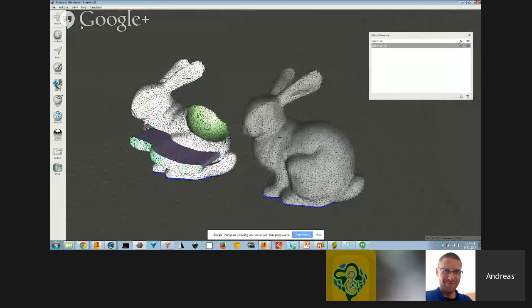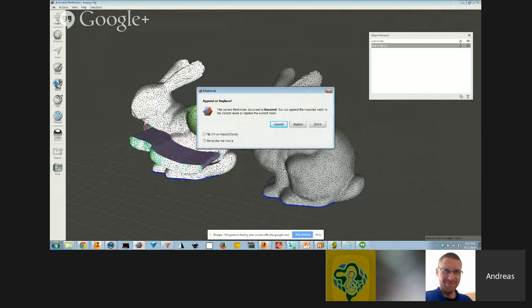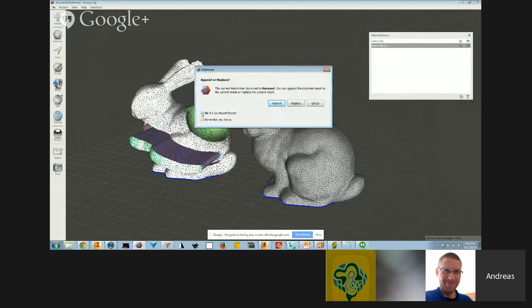Okay, so now what I'm going to do is open up the finger. I'm going to go to my import button and click import, and I don't remember if the option was on or off. I think we do want to check it. So there's this option when I'm importing.